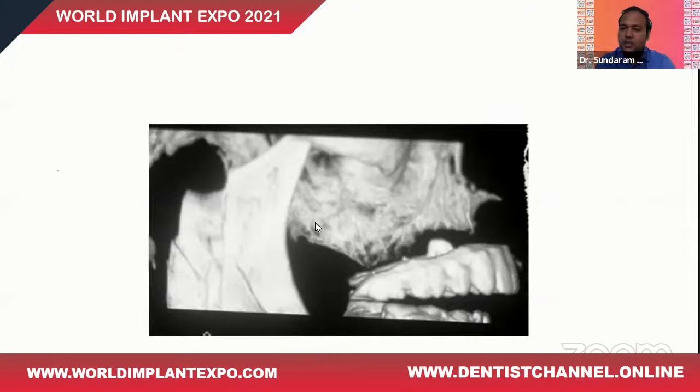In certain cases, you can also completely fabricate the prosthesis by mixing radio-opaque barium salt into it. When you do that, make the patient wear the denture and sit for the CBCT, you are going to get a completely radio-opaque superstructure, below which you can nicely plan for the implants. You can see the bone available over there.